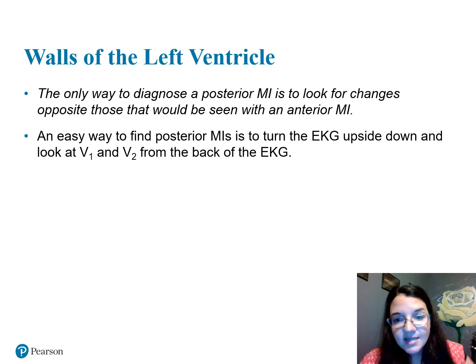Yes, it means what it means. You're going to print your EKG. You just took it on that patient. You're going to flip your EKG printout, your paper. You're going to turn it upside down, because we're looking through the anterior wall. So if I hold that rhythm upright in V1 and V2, I'm looking at the anterior wall.